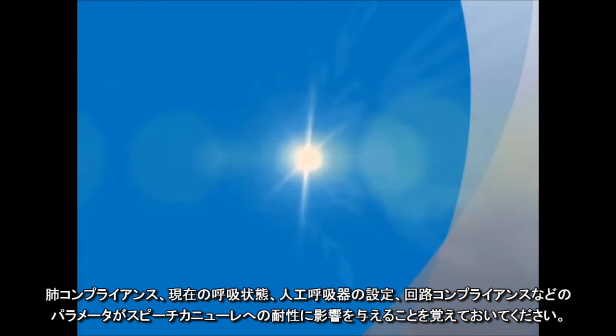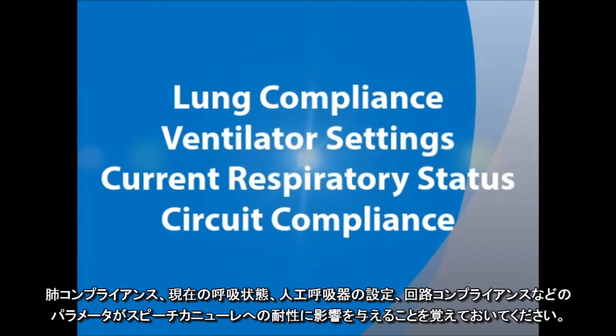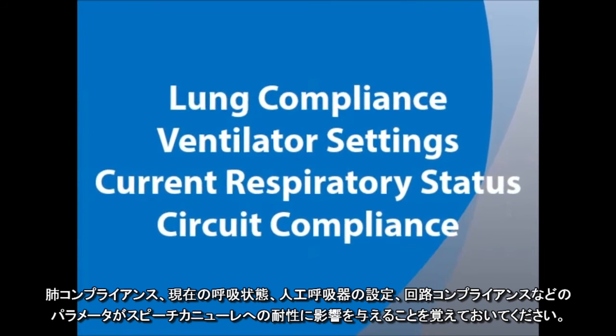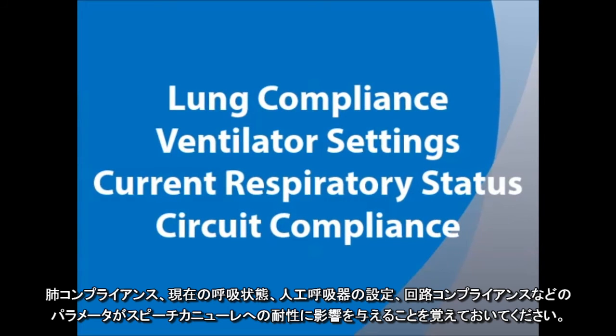Keep in mind patient and ventilator variables including lung compliance, ventilator settings, current respiratory status, and circuit compliance will impact the tolerance of the speech cannula.